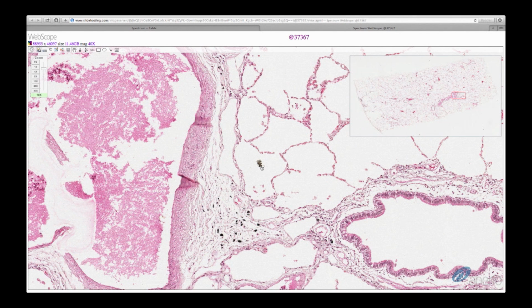Lastly, you might not see it in lab, but know that sometimes these macrophages can combine together and fuse to become a giant multinucleated cell that can be used to phagocytose large foreign bodies and to fight infection, for example, pneumonia.